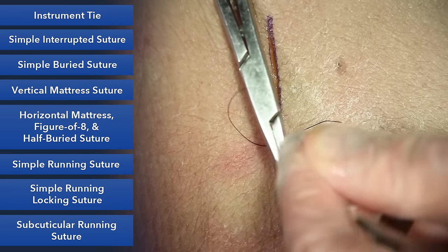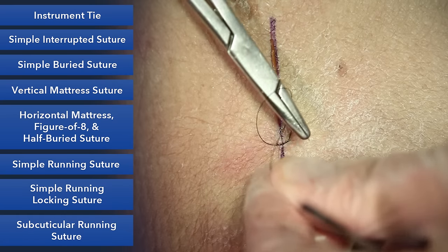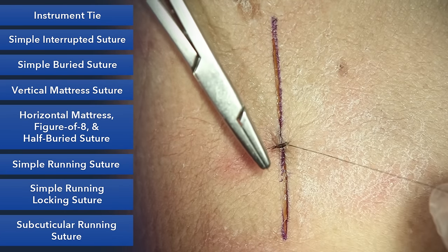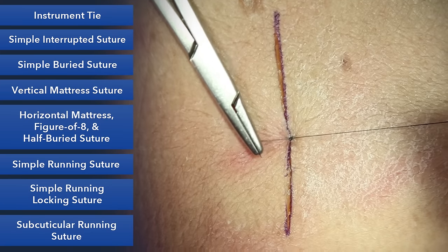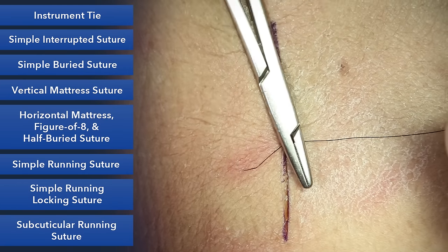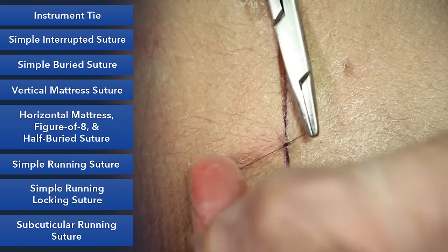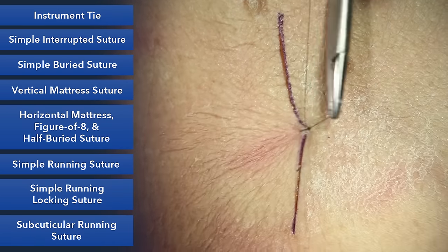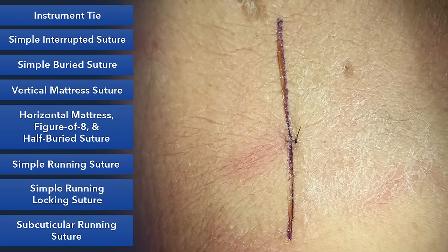Place the needle driver between the two, the short end and the loop end. Now you're going to loop it around only once. Grab the short end and then bring it to the opposite side. Again, squaring the knot. And don't pull up on the suture until you just get it down, and then you can tighten it. And now it's locked in place. I recommend at least 3 throws, instrument between, bring the small to the other side, and done.